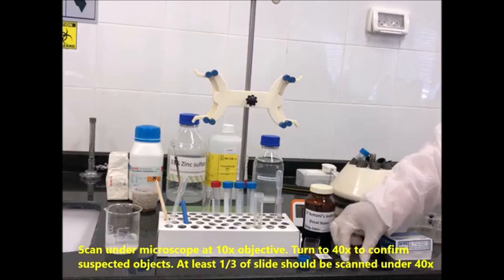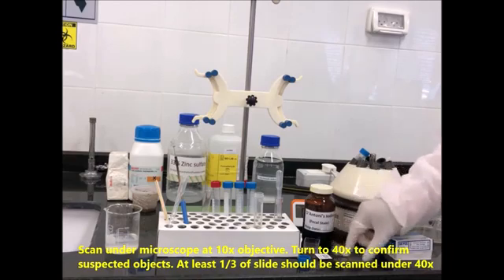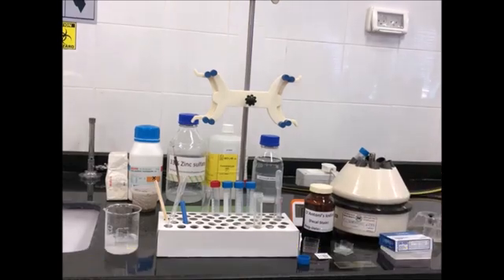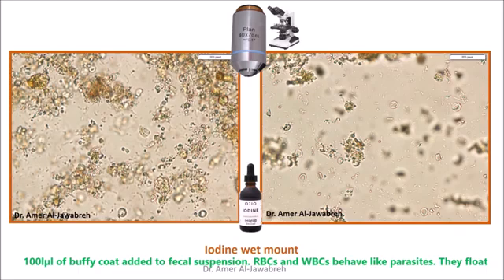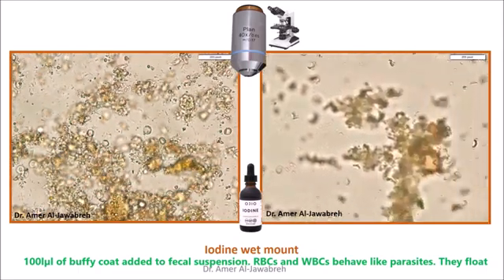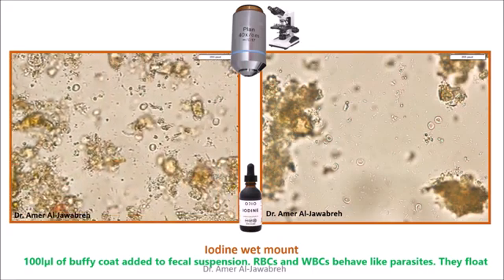Scan under microscope at 10x objective. Turn to 40x to confirm suspected objects. At least 1/3 of slide should be scanned under 40x. 100 microliters of buffy coat added to fecal suspension: RBCs and white BCs behave like parasites. They float.